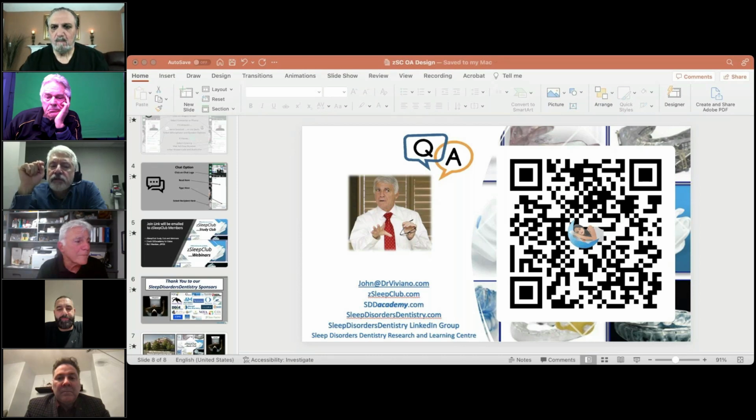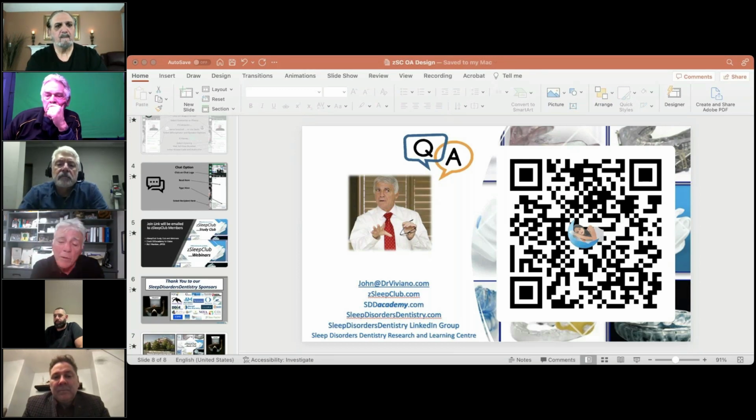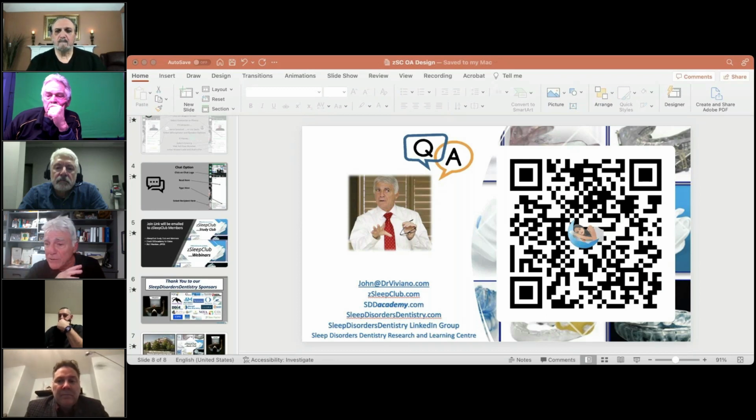Barry, does the new Thermacryl last longer, or is it about the same? About the same. I can't speak to the other material, which is different and which Keith is not using. I don't know much about that. This is very much the same material. We tell our patients with the Thermacryl to take the appliance out, rinse it off, put it into a container filled with water and peroxide, and leave it there. Some people change the peroxide every day, some every third day, and you can leave it for up to a week before changing it. That changed everything in terms of staining and really kept them clean.